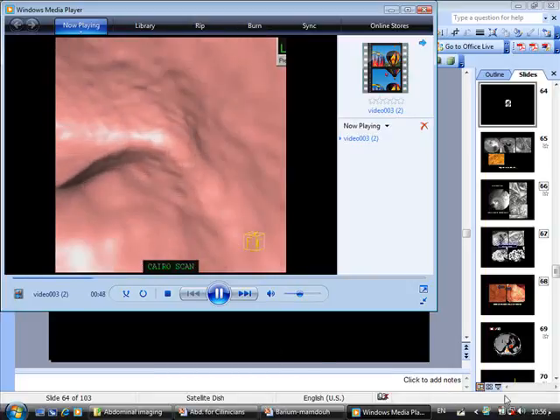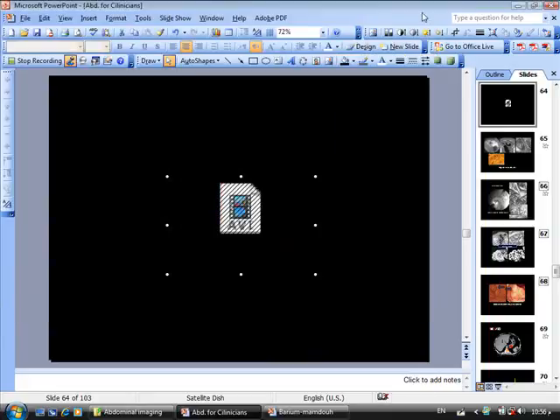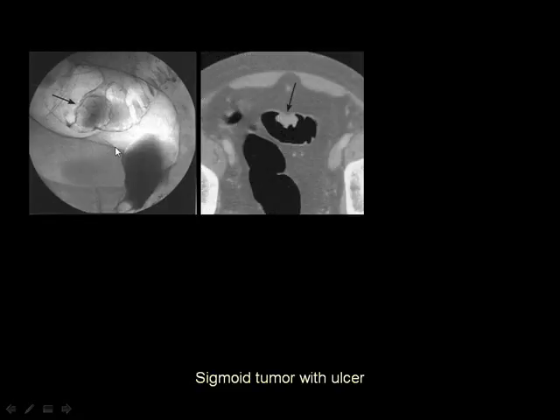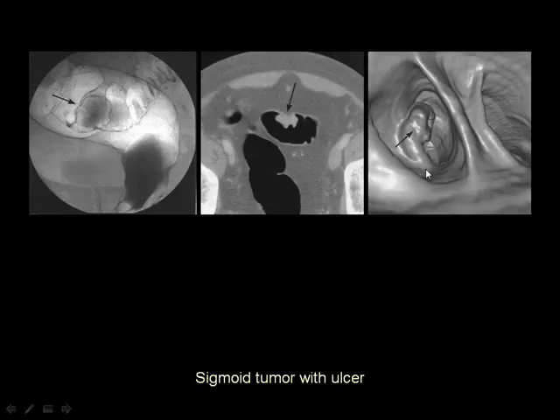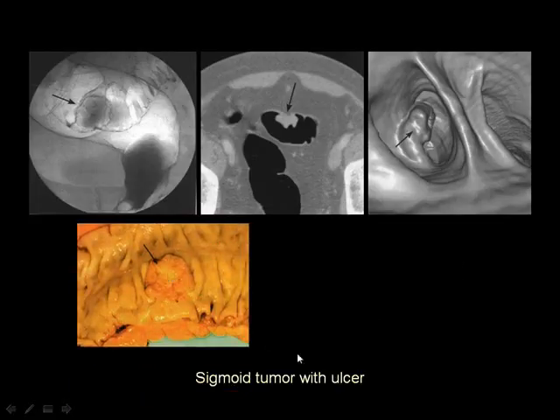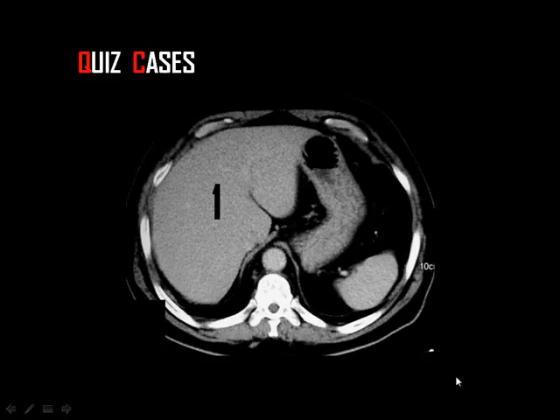A polyp inside the colon can be identified by virtual colonoscopy. If a polyp shows ulceration at its tip, this is suspicious for malignancy. This is demonstrated by a case where a polyp with an ulcer at its tip was seen on virtual colonoscopy, and after resection was proven to be sigmoid carcinoma.